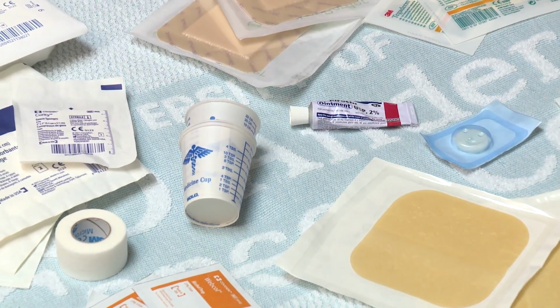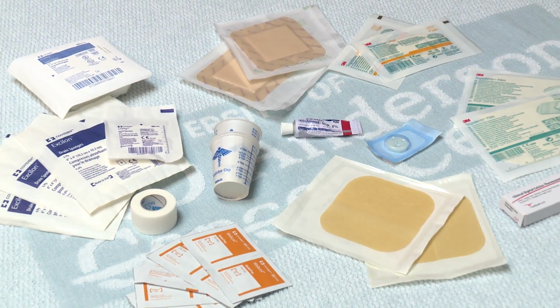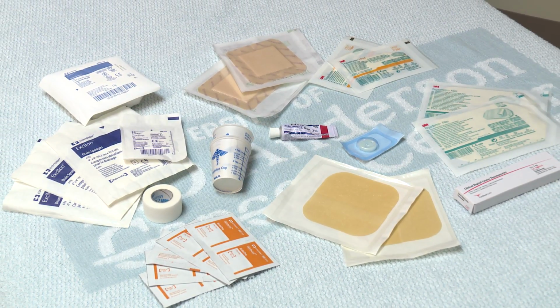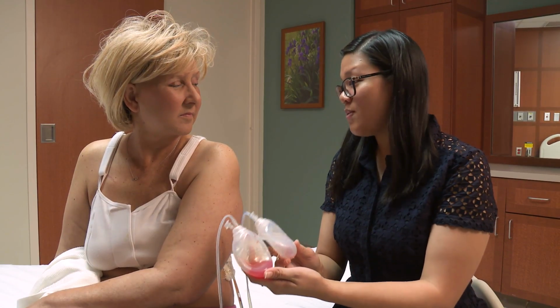If your incisions or drains require dressings, you will be given the supplies you need to take care of them. You may not require dressings. If you run out of supplies, you can buy more, such as gauze pads, at any drugstore. We recommend a caregiver, who can be a family member or a friend, care for the incision and drain sites.